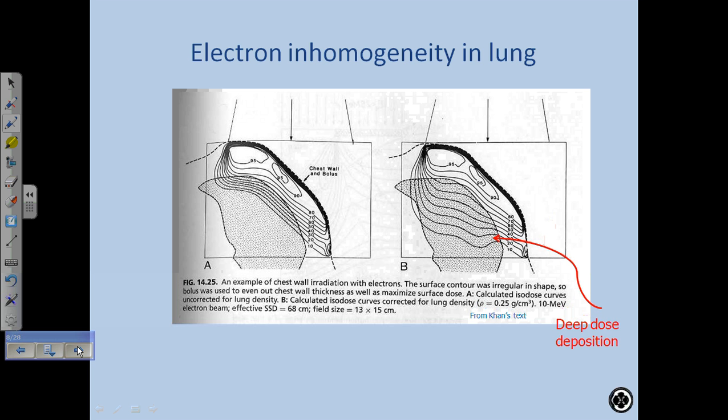All right, and then this is what an isodose distribution looks like. This is the patient's skin. It's an axial cut of the patient's skin with isodose lines 95, 90, 80, 70, etc. And then over here you've got a lung.